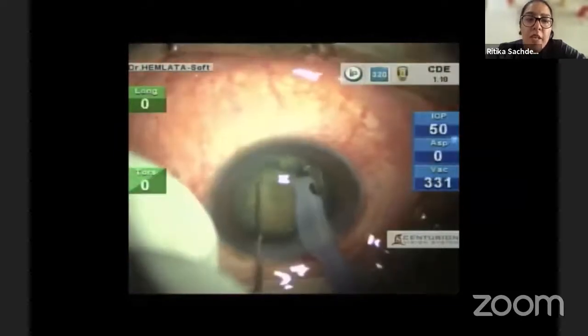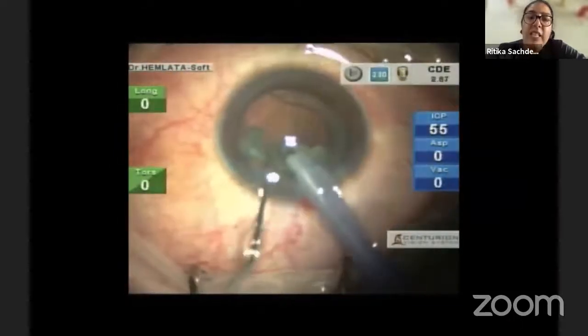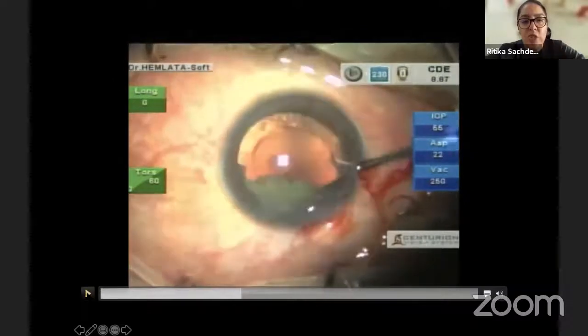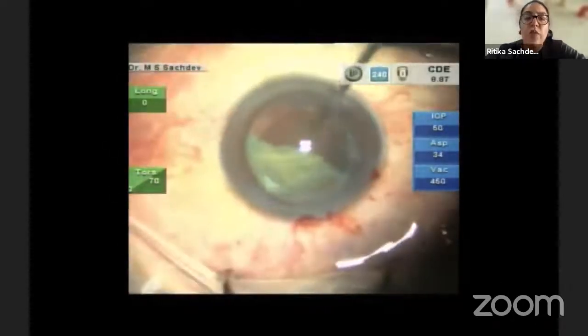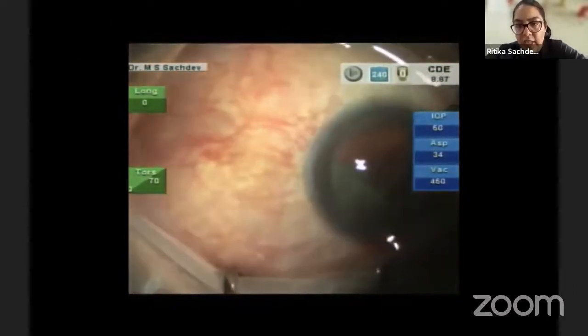Now, what is the problem here is that we've done a hydro maneuver and not decompressed the bag. This bag has already been inflated by the byproduct of femto, which is the gaseous byproduct. You see here that the red reflex has become very prominent. That's so because there is no PC. Now you have no posterior capsule, but you have a large heminucleus. So what we're going to try and do here is to resort to the IOL scaffold technique.